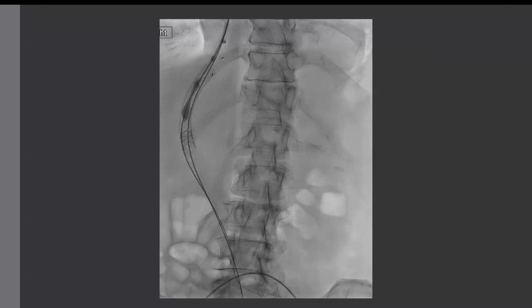One of them is a small uncovered, balloon expandable stent. That's probably the most important thing, a balloon expandable stent. And you put that next to another TIPS stent. You have your main TIPS that was there before, and you just leave that. But through it, you're putting another TIPS stent with a balloon expandable stent next to it.